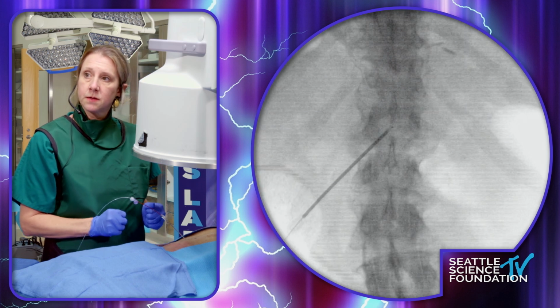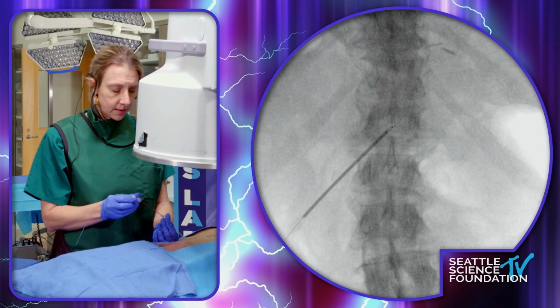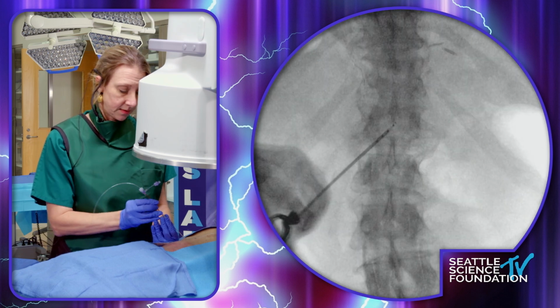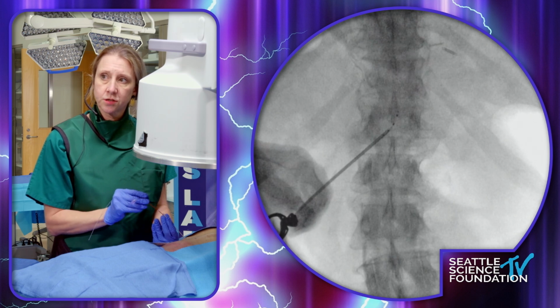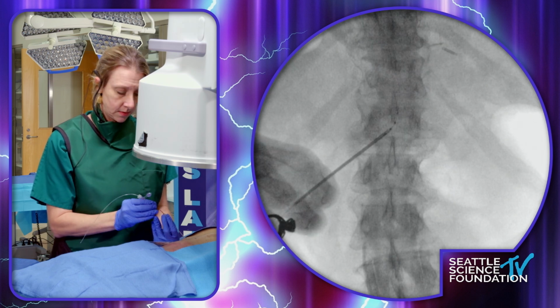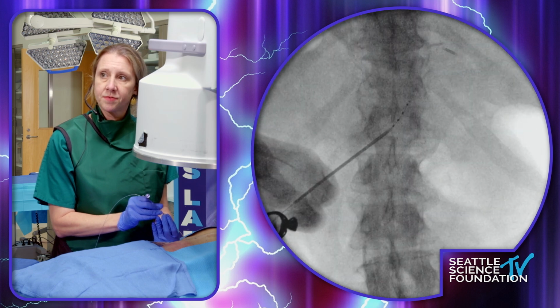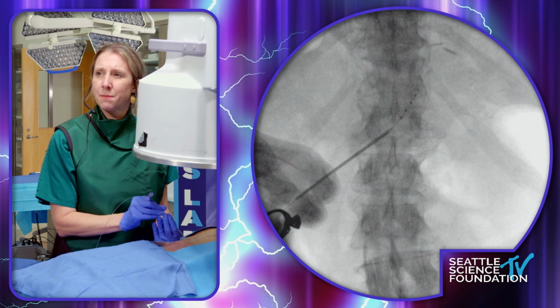All right, so this is the live portion of the procedure, live fluoroscopy. So as I advance my introducer under live fluoroscopy, I am trying to take advantage of that curvature to cause it to exit out the foramen. I am shooting for the inferior aspect of that pedicle.